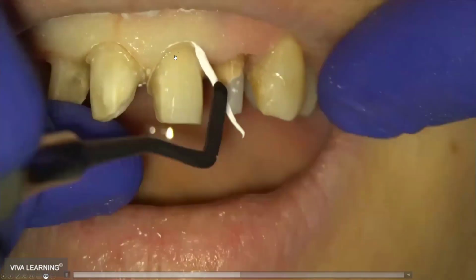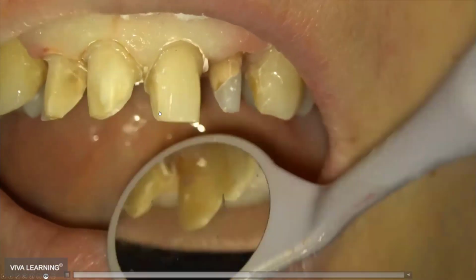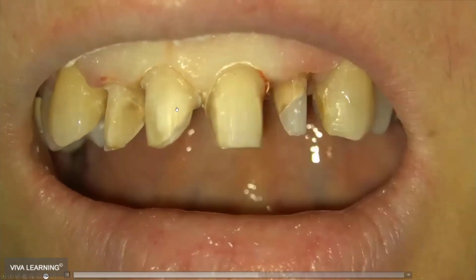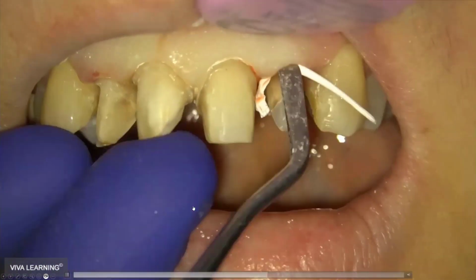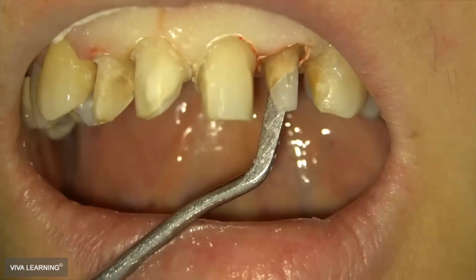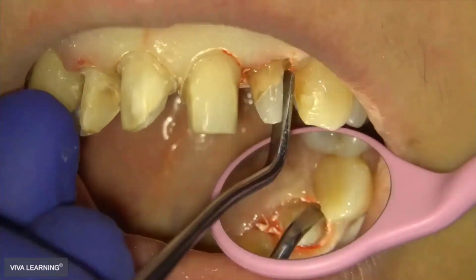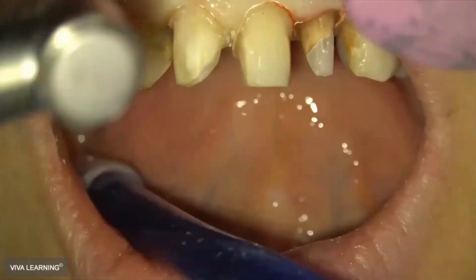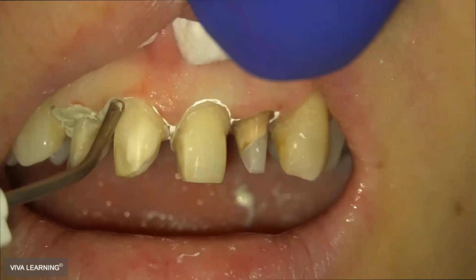So by having a very clear white material around the sulcus and around your shoulder, it will be very easy, when you need to place the margin in the software, to see the difference between the tooth texture and the Teflon tape, that it's bright white. And after I place one cord of Teflon tape, you just have to inject easily the retraction paste.